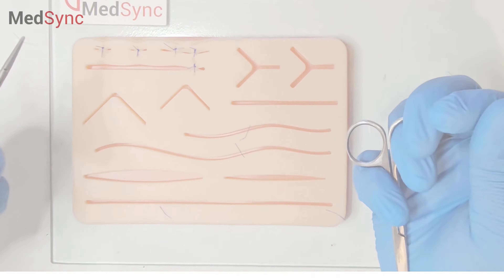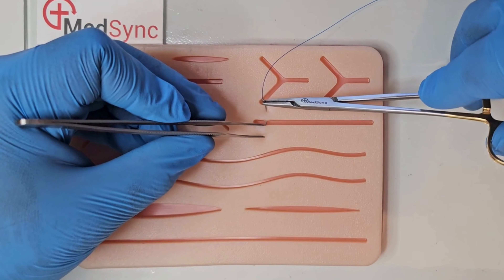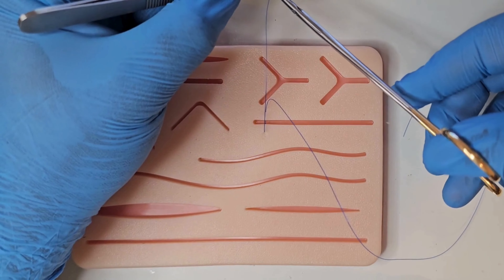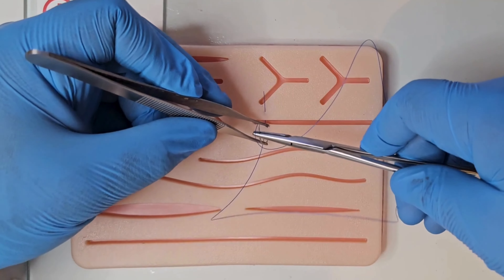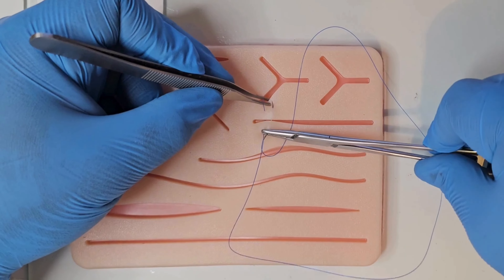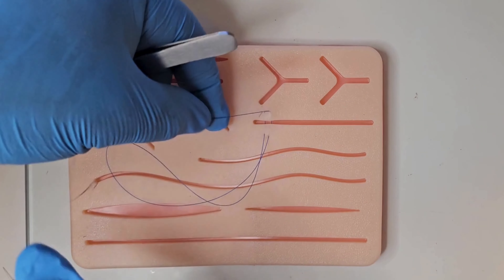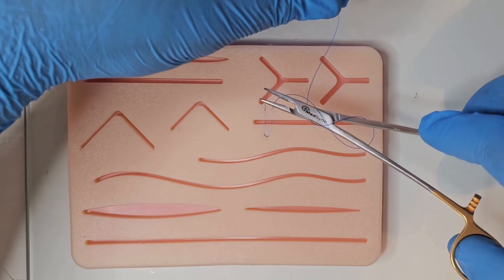Mattress sutures are useful for wound eversion and closing wounds under tension. It starts like an interrupted suture. After you exit opposite the side you started, take a third bite next to the second exit point, finishing next to where you entered. Knots are performed as usual, starting with the surgeon's knot followed by two reef knots.